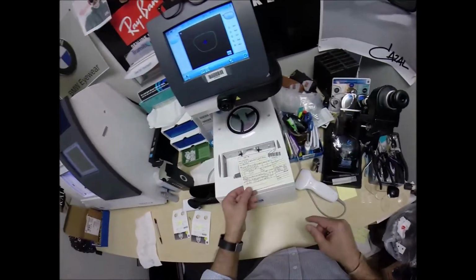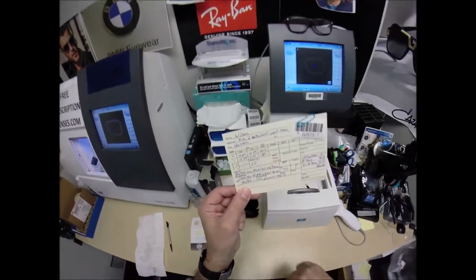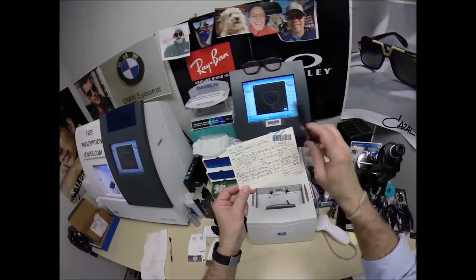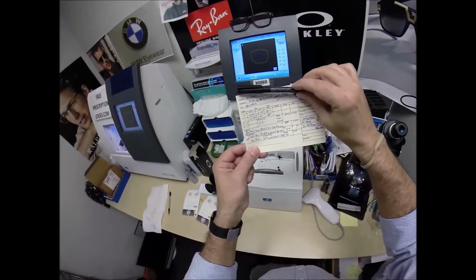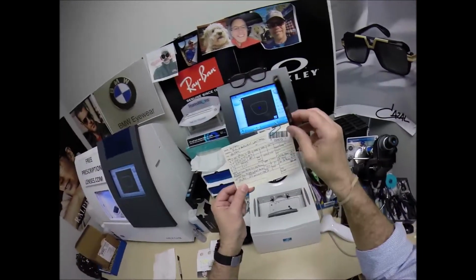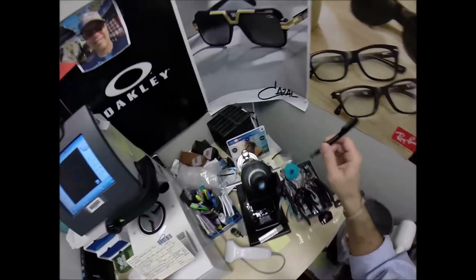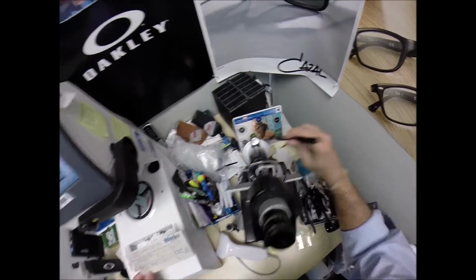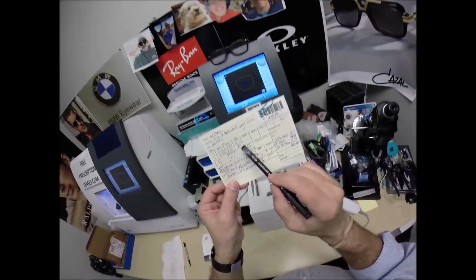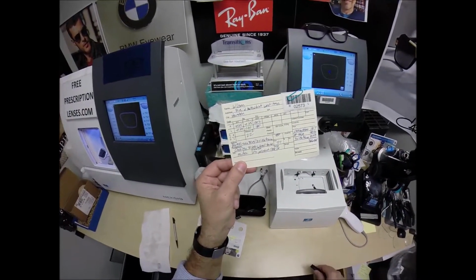This is known as final inspection. I'm just inspecting the glasses that it is the correct prescription. Now you would think that 2 and 180 are very far apart. They're not. Again, a straight line is 0 to 90 to 180. Your right eye, you're at 2. I won my $2. Anyone old enough to remember that movie? But your left eye is 180, which is over here. Now, 0 and 180 are the same number. I don't know why they don't just use 0, but they do use 180 to avoid confusion. Even though on the lensometer it's marked as 0, we pronounce it as 180. So you're at 2 degrees for your right eye. You're literally at 0 degrees for the left. So you're only 2 degrees of separation from your prescription and Kevin Bacon's prescription.